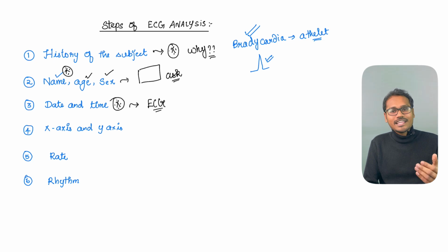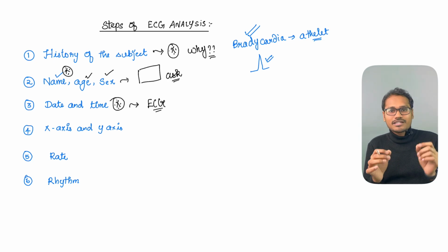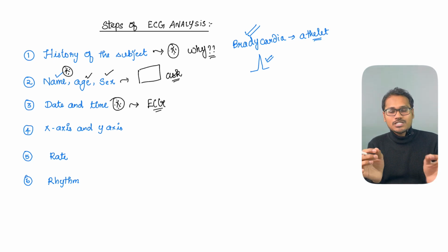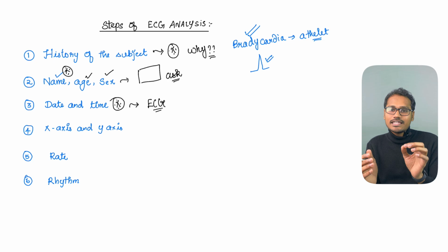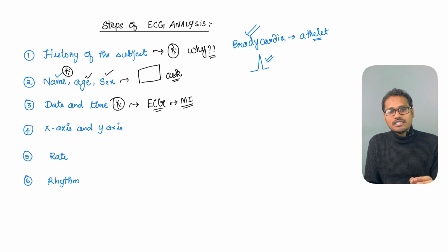So why I am saying like this is because the patient would have taken an ECG like 3-4 months back when he was going for a routine test or a medical checkup. So at that time, he did not have any complaints and he has an ECG strip of that period. But right now, he is having a chest pain and it is indicating the signs of myocardial infarction. But he is showing this ECG. When you read this ECG, the ECG is completely normal. The patient might give you a complaint, but it was not taken at that moment. So always some conditions like the myocardial infarction, they require an acute ECG or an ECG which was done immediately during the time of the symptoms.